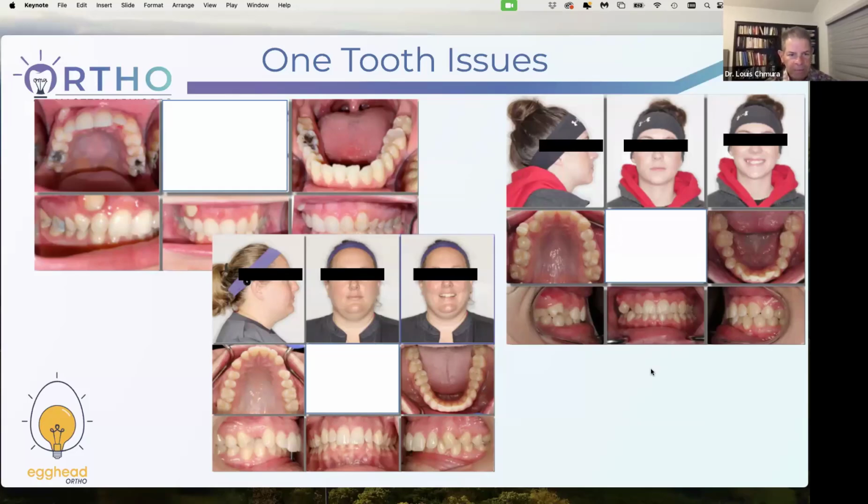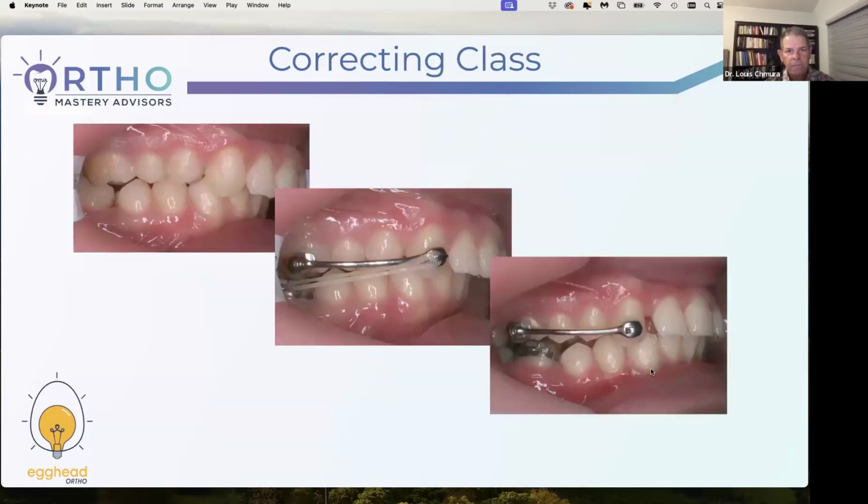On the lower left, that cuspid and the upper left first bicuspid, very difficult to do with aligners. That canine that's highly impacted in the upper left, right? You can bring it down. I mean, orthodontists do this, and you could learn to do it, but man, that is a lot of work for something that there's a million cases without doing that. You can do easy ones without having to even think about those.